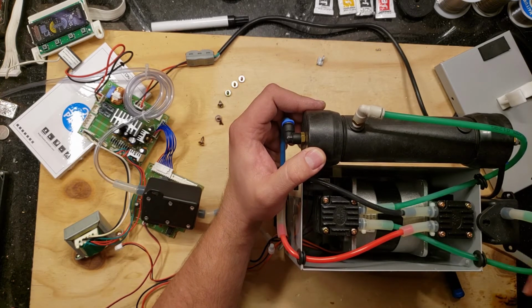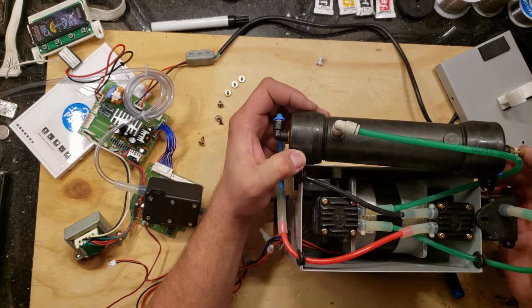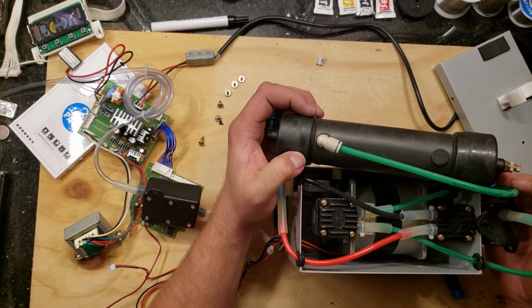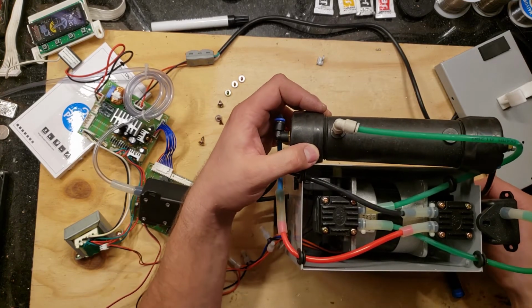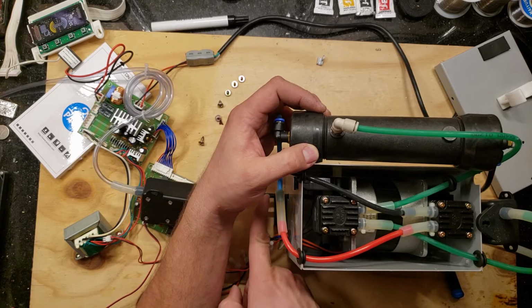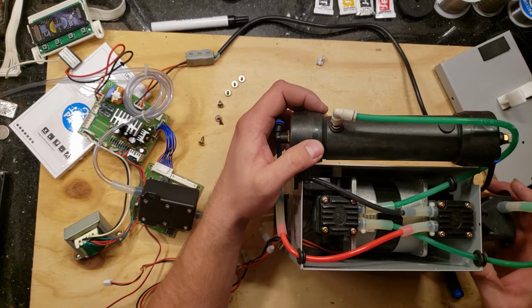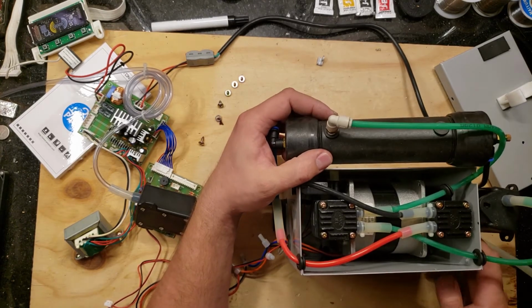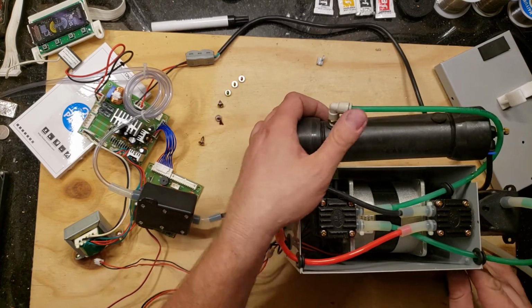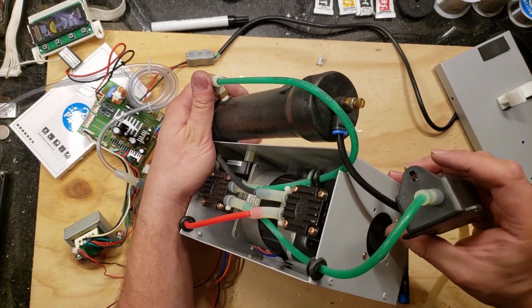This goes out to your nose, and then the reject line has a little valve right here that can be adjusted, and that goes through this box for some reason and out. So this is just a dump of used air. So this looks like a very nice compressor. Also there's two little fans, little blowers. I guess that's to cool the compressor.